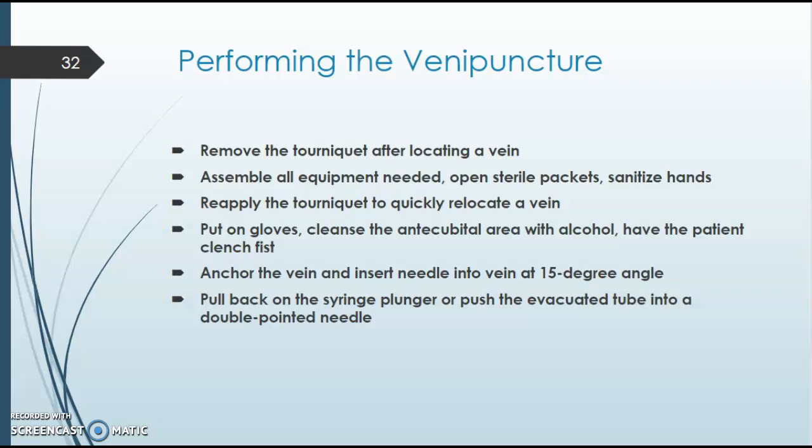But once you're done with the draw, first thing before you remove the tubes is to release the tourniquet. You don't want that added pressure when you're actively in a vein due to risk for hematoma and excessive bleeding.